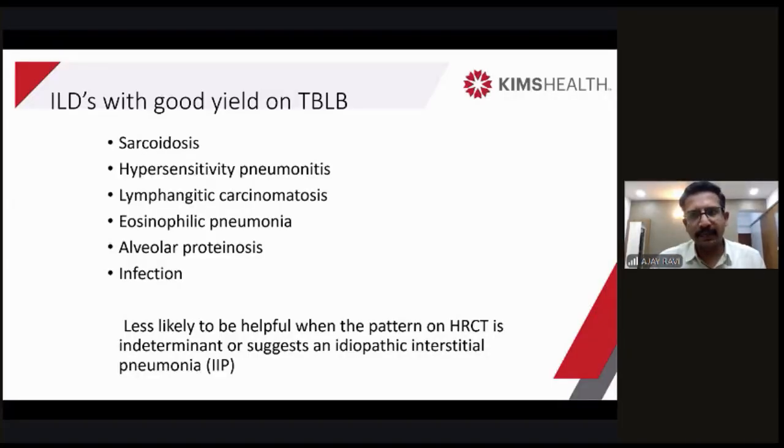You have to agitate a little bit, moving it forwards and backwards for some time, so that you can see the forceps opening on the fluoro, and then you push it, and you feel the resistance, and you make sure on the fluoro that it is not going till the chest wall or the pleura, and take multiple biopsies. This will reduce the number of fluoro shots and increase your confidence when you do biopsies. It also helps you to rule out an immediate pneumothorax after this.